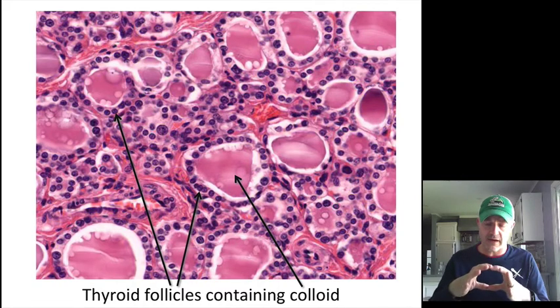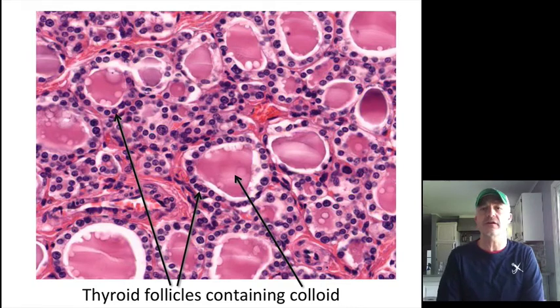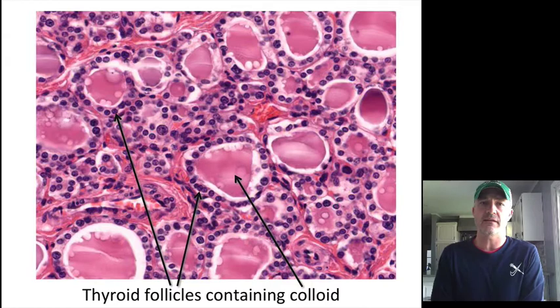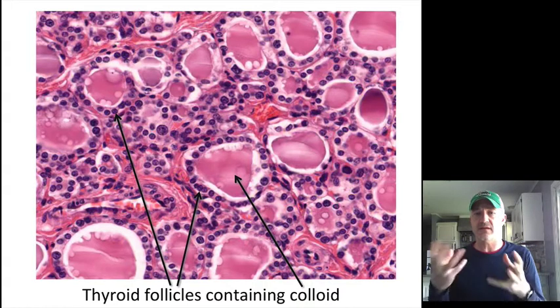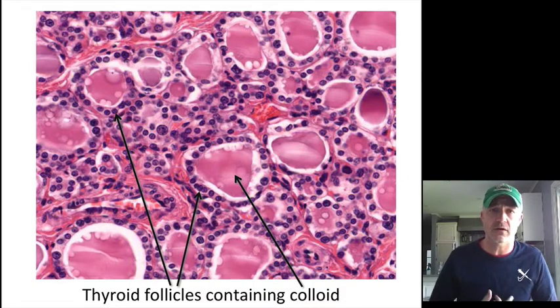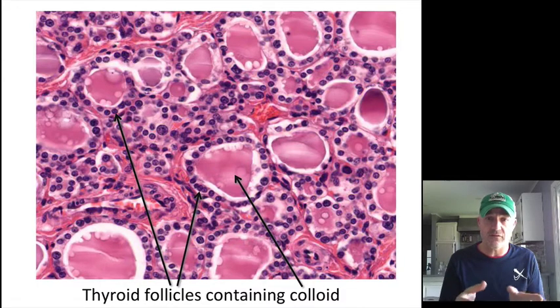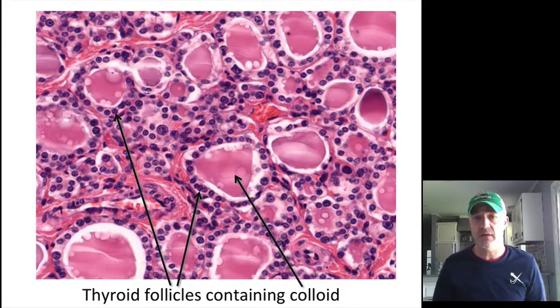These are thyroid follicles, so you get the little circle like this. The fluid on the inside holds the precursors for making these particular hormones. So when the thyroid gland is stimulated to make these hormones, it's going to take some of that fluid in, convert it to the thyroid hormones. We're going to see these are actually T3 and T4, is kind of what they're shortened to. So it stands for thyroxine and triiodothyronine. The stuff will get taken into these cells and converted to those particular hormones and sent into the bloodstream.